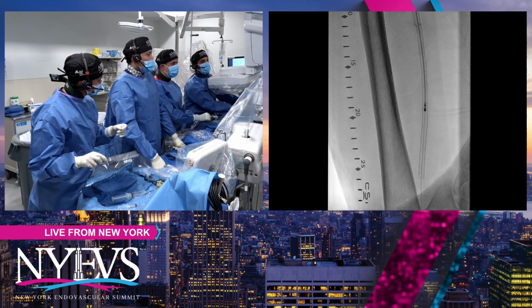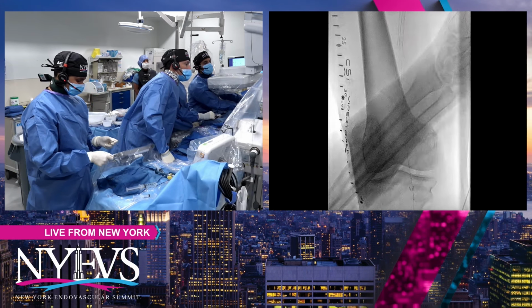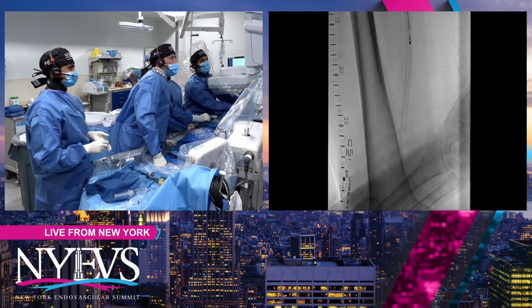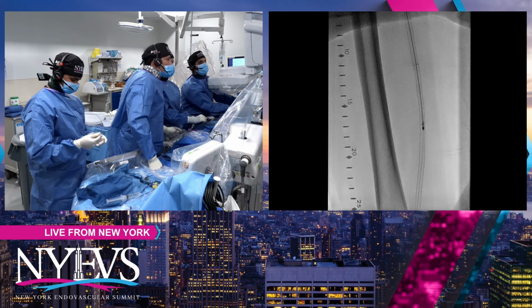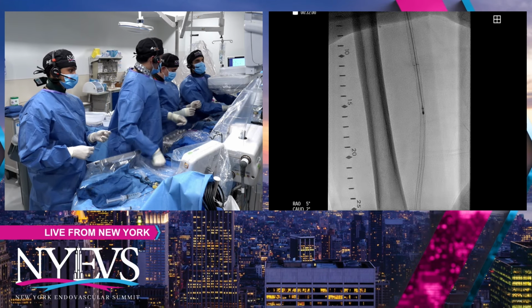I think here you found an anatomical issue in a couple areas, and this is the first time you're trying to reopen it. It lasted 3 years from the history, so I don't know if you've proven that this is not going to buy you a couple more years if it's looking a little bit better at the end.